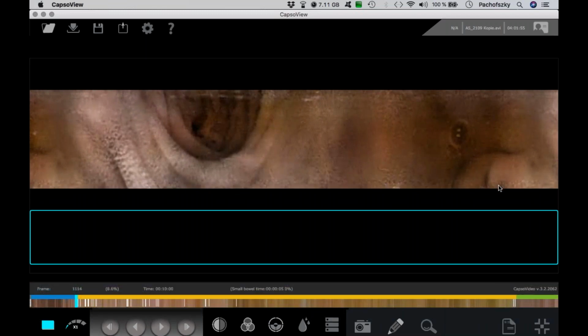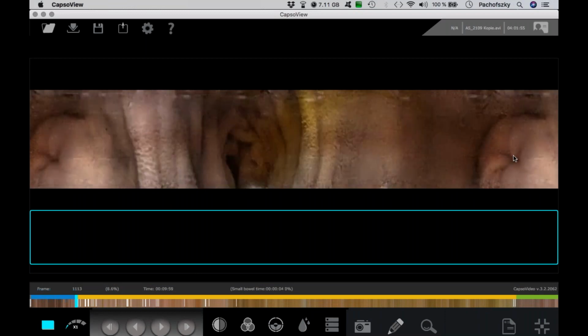In this area you can see this structure. You will see it quite often. You can see it here now clearly. One of the differences with the lateral viewing system is you can see on the left side the same as you can see on the right side. That's the pylorus from the duodenum. It's because we have not even a 90-degree angle of the 4 cameras. It's a little bit bigger. Here in the middle, the software will reduce it.